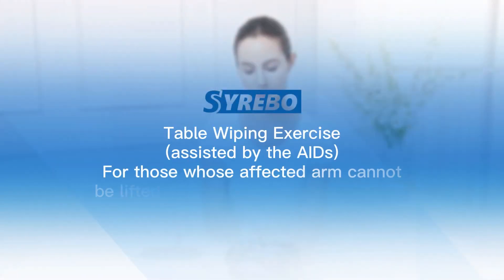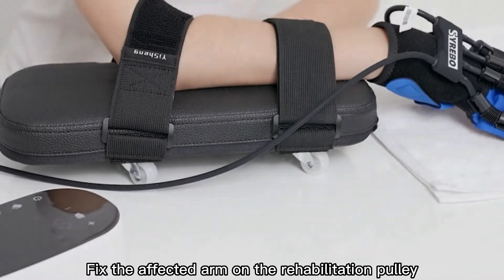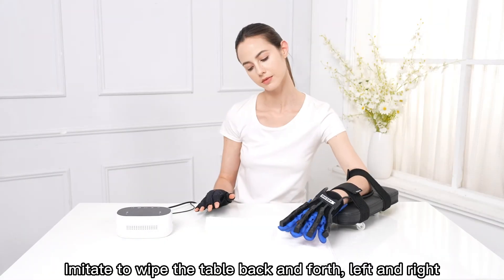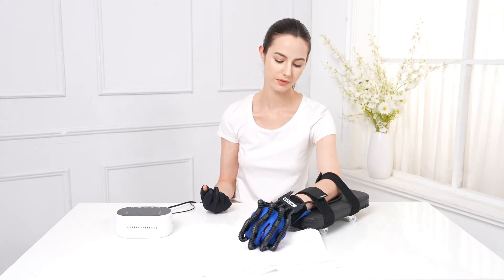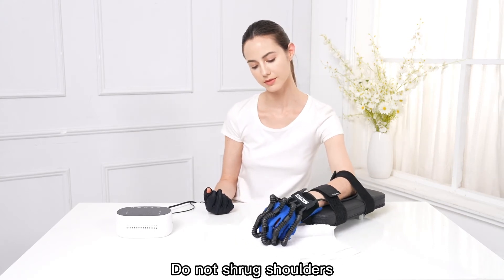Table Wiping Exercise Assisted by Aids — for those whose affected arm cannot be lifted but can be moved on the table. Fix the affected arm on the rehabilitation pulley. Imitate wiping the table back and forth, left and right. Stretch the affected arm as far as possible. Do not shrug shoulders.